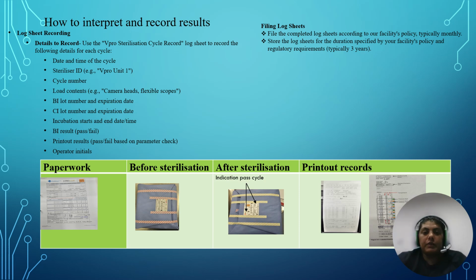File the completed log sheet according to our facility policy, typically monthly. Store the log sheet for the duration specified by your facility's policy and regulatory requirements, typically 3 years.